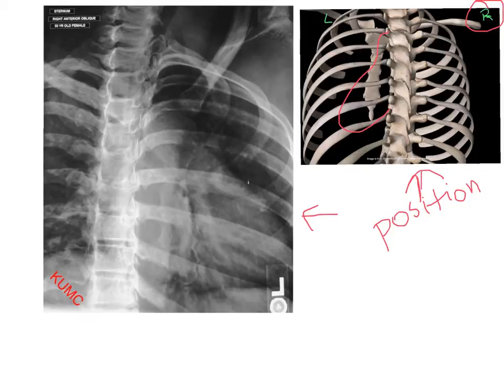Looking at the actual skeleton, we've noticed that our patient is in a PA position. We've turned them only 15 to 20 degrees RAO with their right side to the IR. In looking at this image, you can tell that there's not a lot of obliquity in this patient.